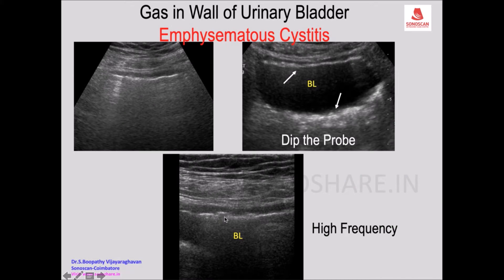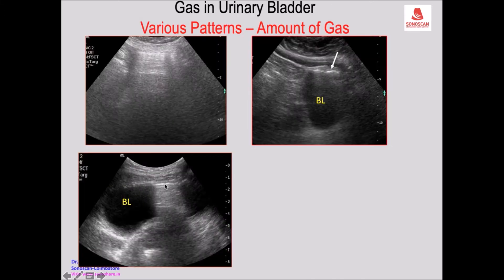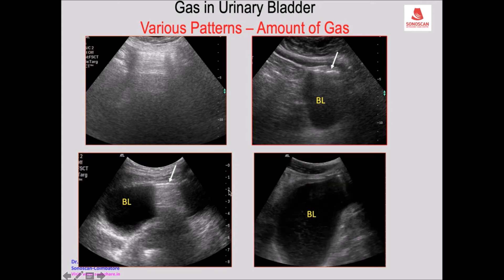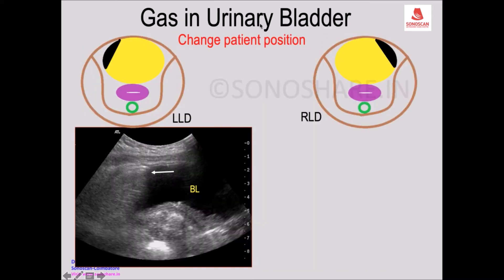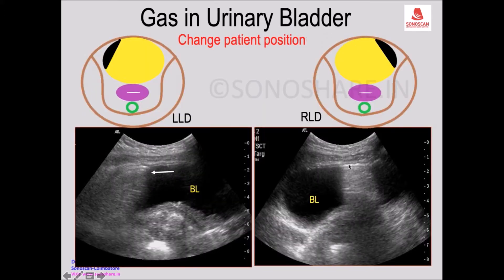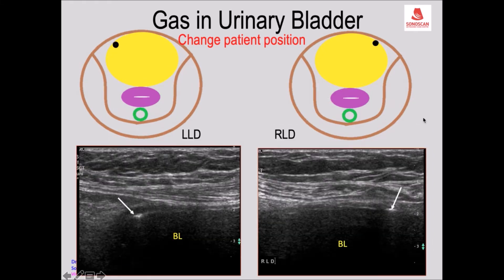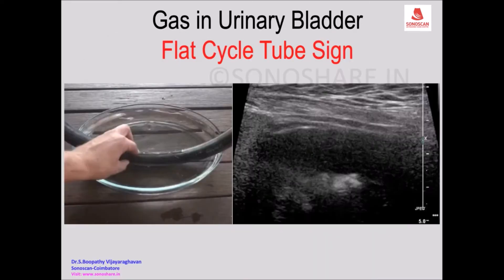Gas within the wall will remain the same in spite of pressure, showing that it is well contained within the wall - this happens in emphysematous cystitis. Here you see most of the bladder is normal, but you see a single bubble of gas that moves to the left side, and you will see the gas column in the left side with dirty shadows within the domain of the urinary bladder.